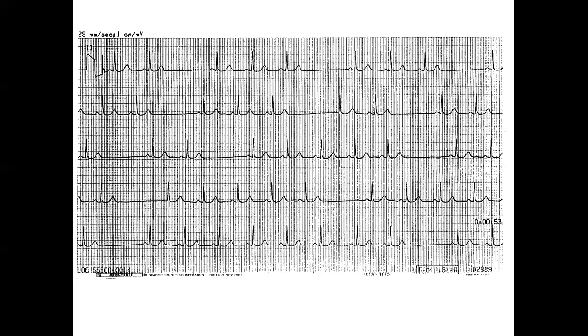What does that tell me? Sinus node is firing, but didn't get to the atrium, so no P, no QRS. Sinus node is firing, but didn't get to the atrium, so no P, no QRS. But this interval is exactly 2 basic cycle length. So this is a type 2 SA block.